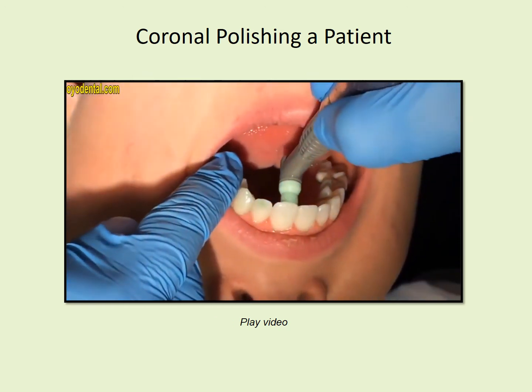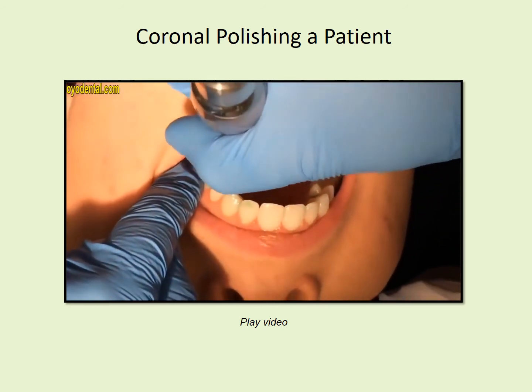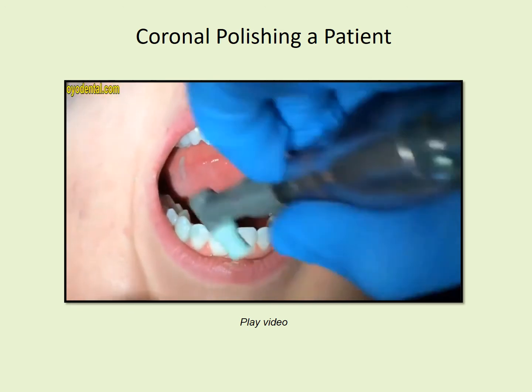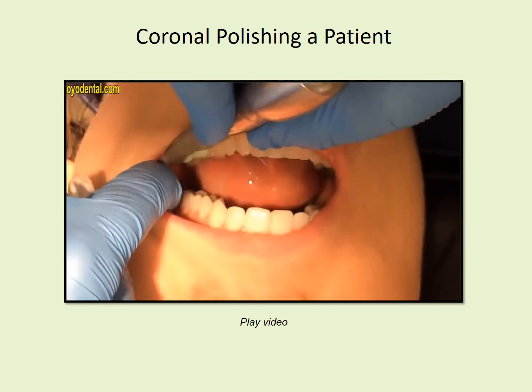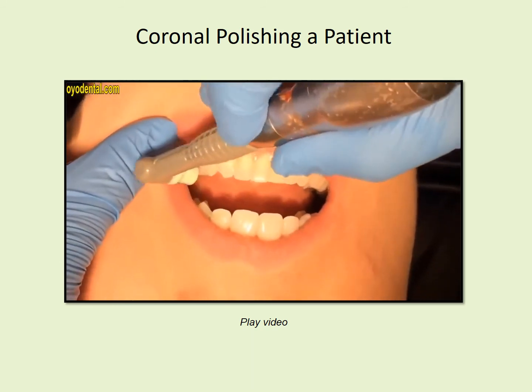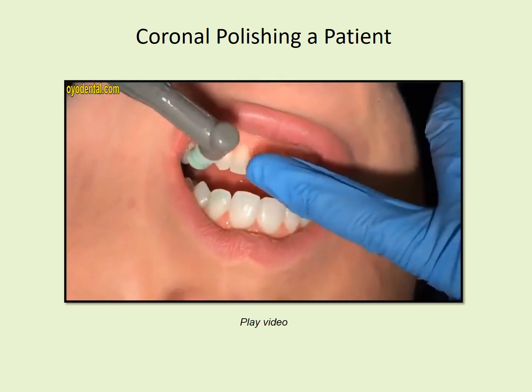If my patient presents with stain on the anterior lingual teeth, I will use my mirror to take a look and make sure that I'm using the prophy polish as a stain remover. A lot of patients hate this, and they hate to swallow it. So if my patient is filling up with water or saliva, I'll let them close on the saliva ejector. Candy here is doing just great. She doesn't have a lot of spit going on, so thanks, Candy.